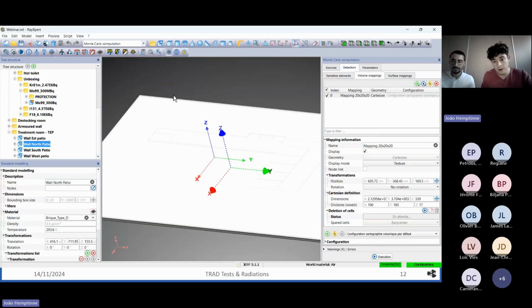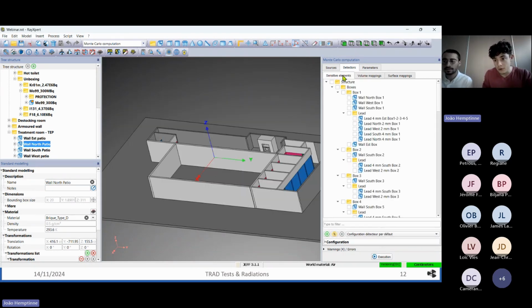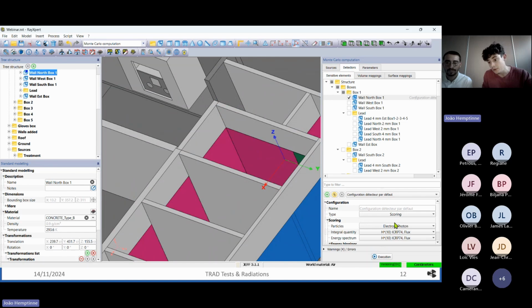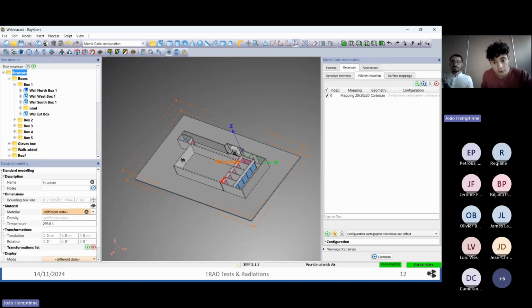Okay, thank you, João. So now the geometry of our model is over. Our sources are set. So the final step is to set the sensitive elements and the mappings. For the sensitive elements, you go in this menu, and in this example, there are no physical sensitive elements. We just set a 3D mapping, but if you want, I don't know, the doses in this wall, you just check here the wall that you want to analyze, and here in the configuration set, you choose the quantity that you want to compute. Okay, so let's focus more on the 3D mapping.